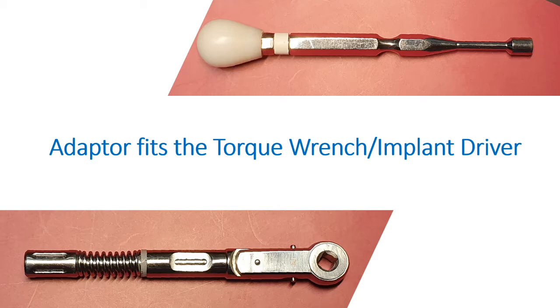These instruments should only be used in the early stages with the adapter, and then the adapter and carrier removed from the implant, and final seating only performed using the extender, which has no locking mechanism. I cannot overstress the importance of ensuring that you do not try to seat the implant fully using either the carrier or the adapter.